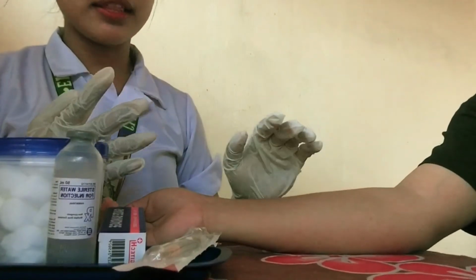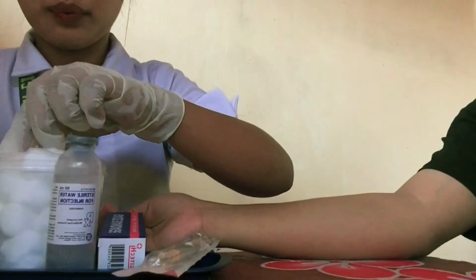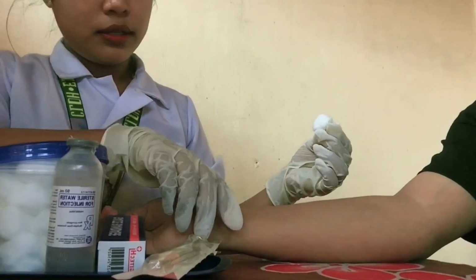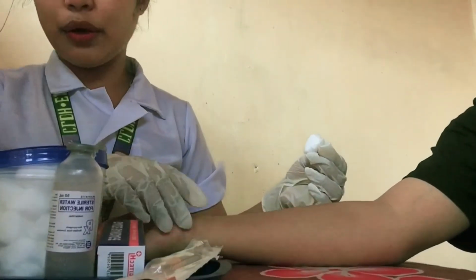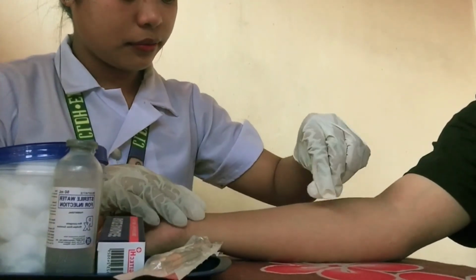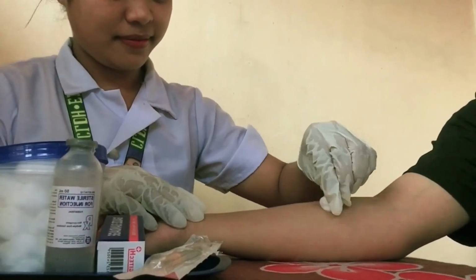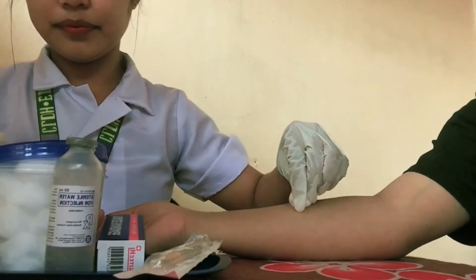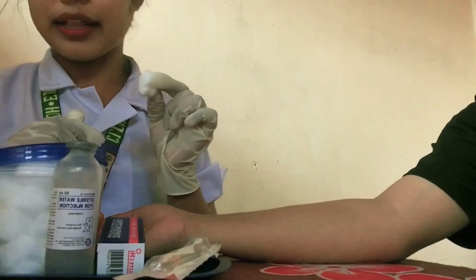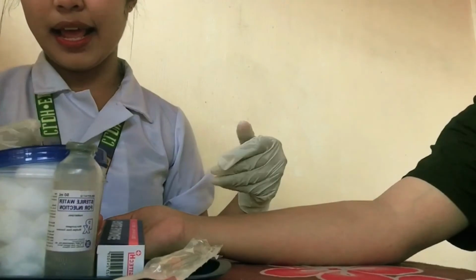After checking the area, we will clean it with a clean cotton with alcohol. In cleaning the area, we will do a circular motion and clean it thoroughly. After that, we need to discard this cotton in its right disposal. Then let us wait for the alcohol to dry.